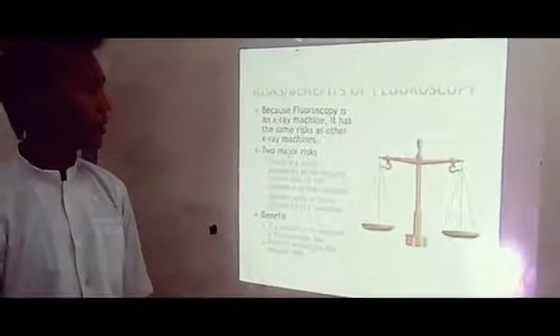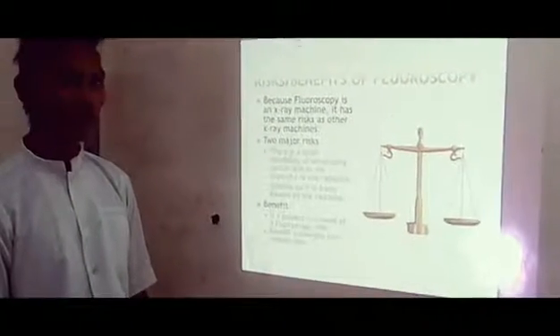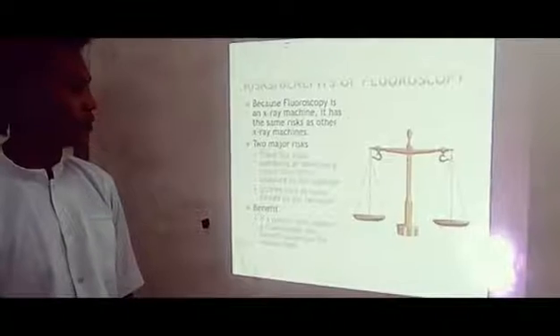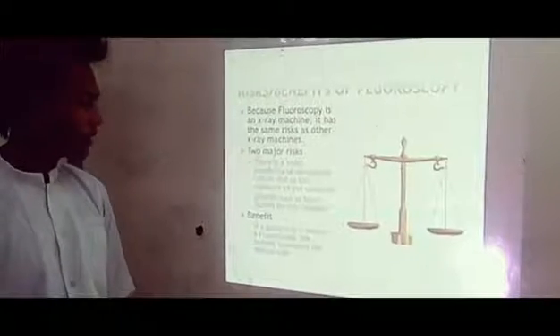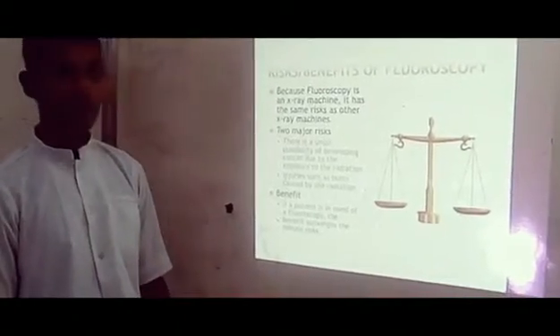Benefits of fluoroscopy. Because fluoroscopy is an X-ray machine, it has the same risks as other X-ray machines. Two major risks. First, there is a small possibility of developing cancer due to the exposure to radiation. Second, injuries such as burns caused by the radiation. Benefit: if a patient is in need of a fluoroscopy, the benefit outweighs the minute risk.